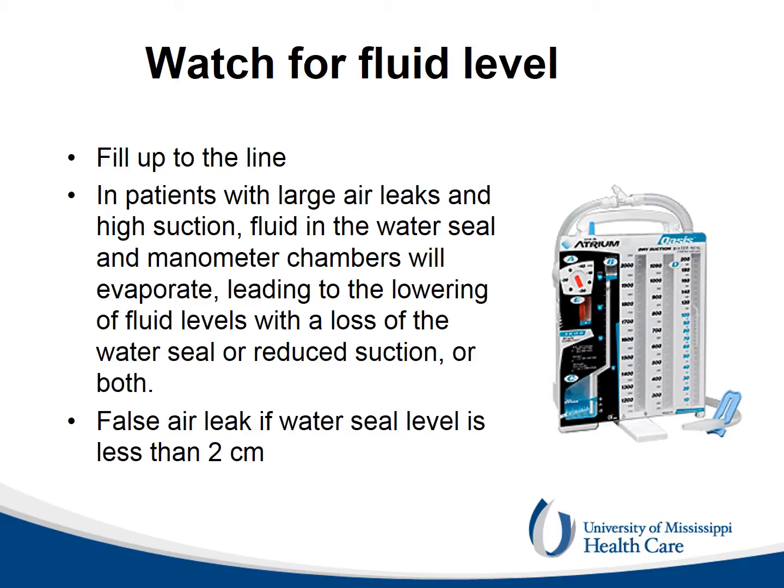The level of normal saline in the water-sealed chamber needs to be kept at 2.0 centimeters when off suction. The level needs to be checked daily when off suction, since large air leaks may accelerate the evaporation of the fluid. A level of less than 2 centimeters may let air enter the water-sealed chamber and be erroneously interpreted as an air leak.